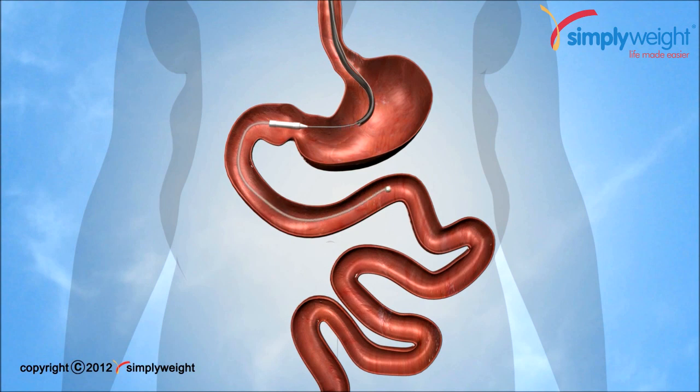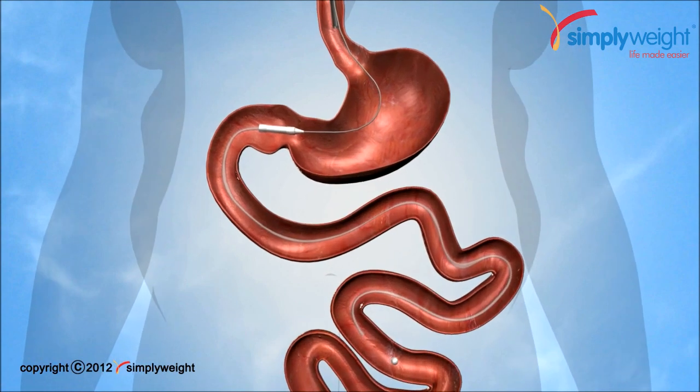This sheath also delays digestion and is known to alter the activation of some of the hormones involved in digestion and release of insulin.